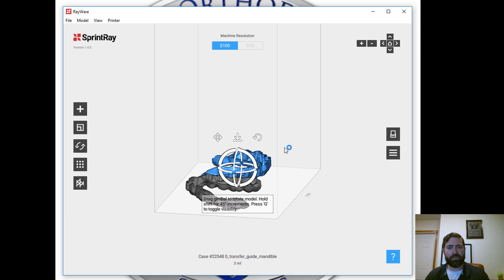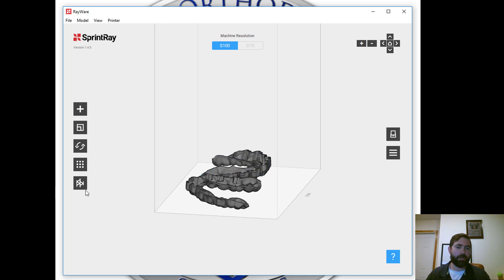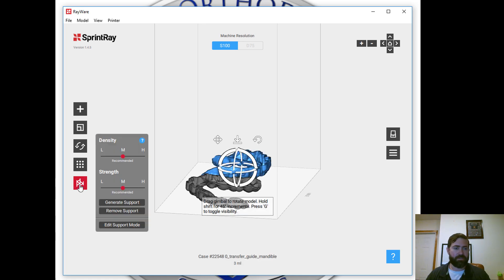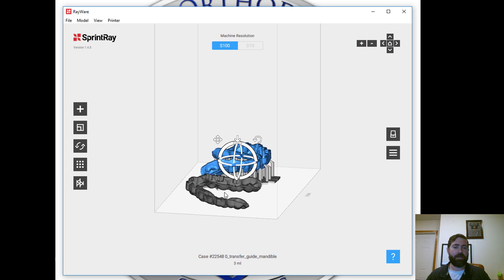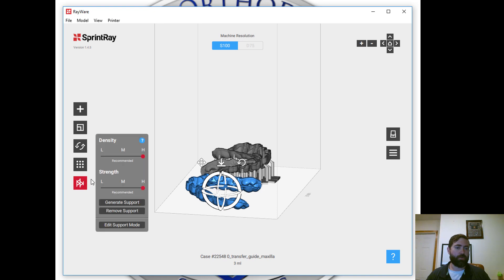Whenever doing a clear material like these indirect bonding trays, we'll want to develop some heavy guides. I'll go to the generate support button and on density and strength, I'm going to turn those up to high, not just medium. I do that anytime I'm doing indirect bonding trays, or if I'm doing occlusal guards or anything using the ortho rigid or ortho clear materials.